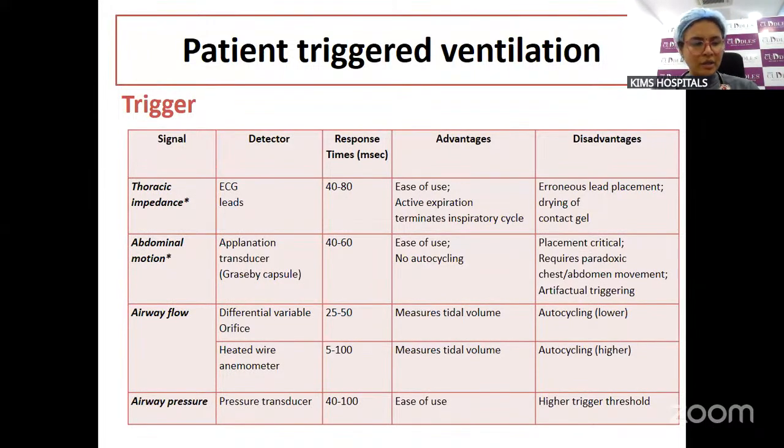So I shall conclude this presentation here. We have discussed some commonly asked questions in neonatal equipment. This is something that is often asked not only in the exams for postgraduates, but is also of utmost use for practicing pediatricians who work in NICUs for common troubleshooting.